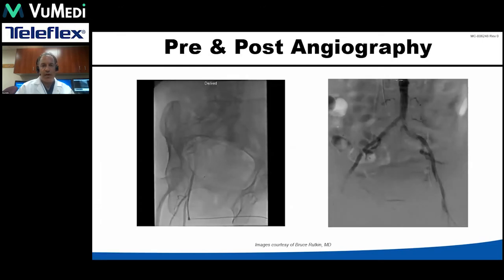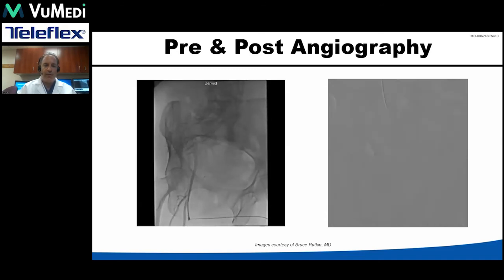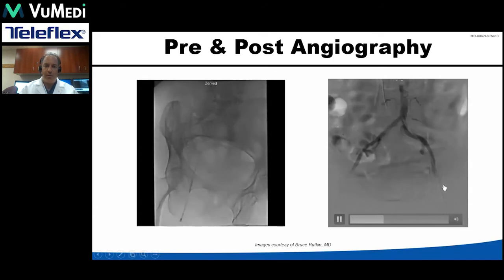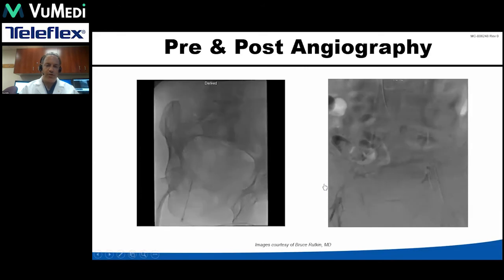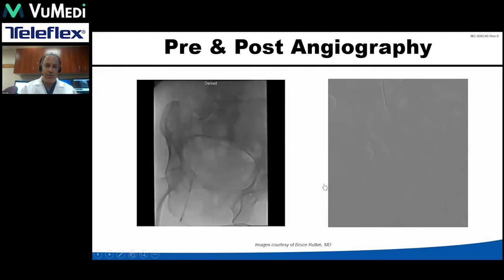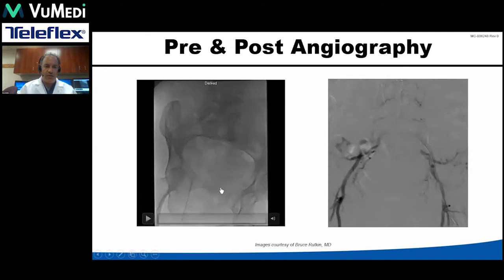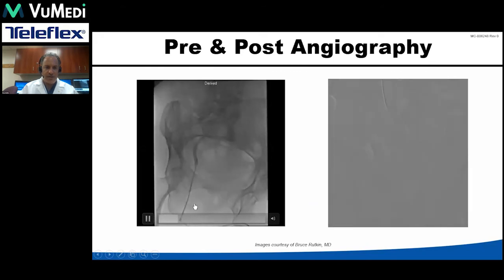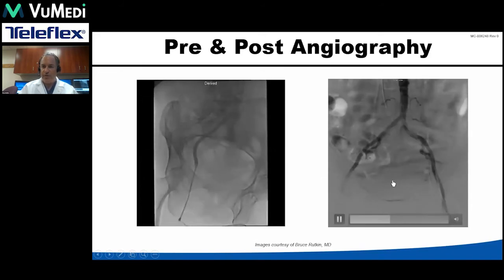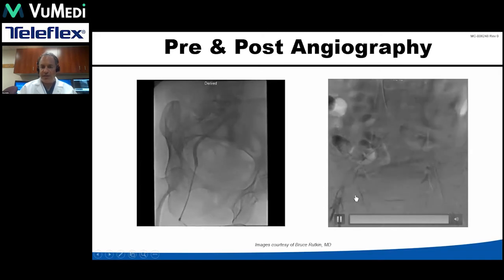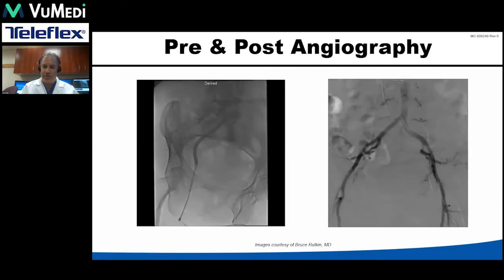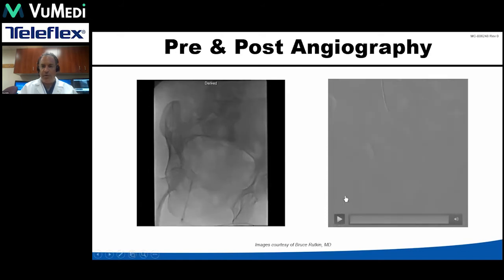I recommend doing pre- and post-angiography. Personally, I think it's extremely helpful so we can assess what the vessel looked like before and after closure, giving us a basis for comparison. Obviously, for patients with renal insufficiency or chronic kidney disease, you want to be very sparing with contrast. You can see here on the left, after placement of our six-French sheath, demonstrating a nice access zone. We went slightly RAO to open up the bifurcation of the common femoral. And here after the case, with the percloses deployed — successful closure, good hemostasis, no significant extravasation of contrast. You can make out a small dimple where the sutures were most likely deployed. This is a good closure.